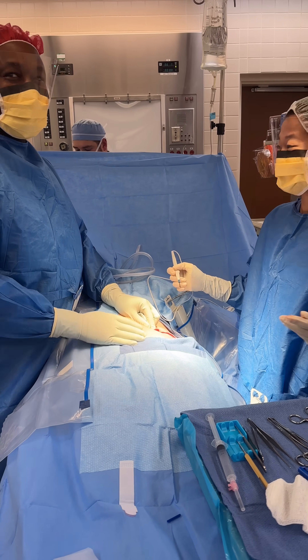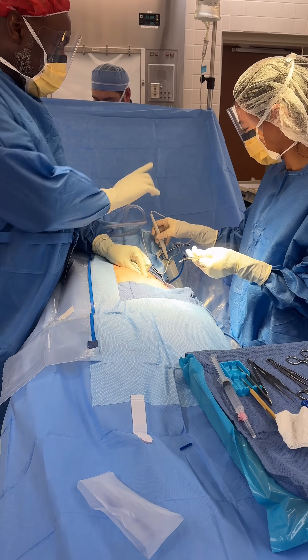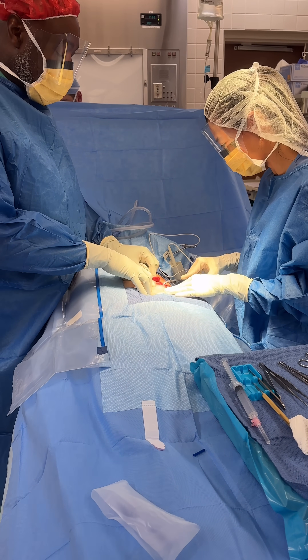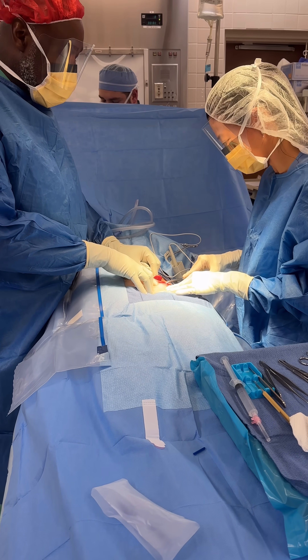You don't even know where the Kelly is, do you? No. All right. Grab the skin — see? Turn the button. Grab the skin. Grab more than that — that's coming out. Grab it, clamp it, lift it up.